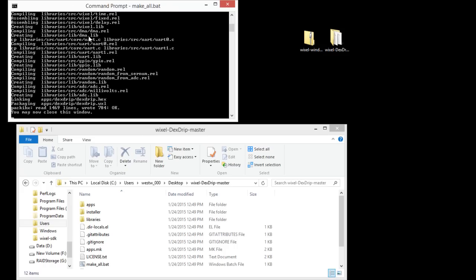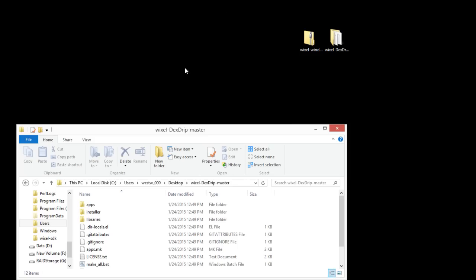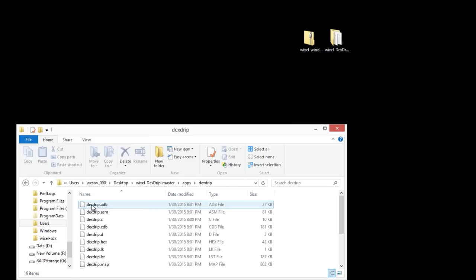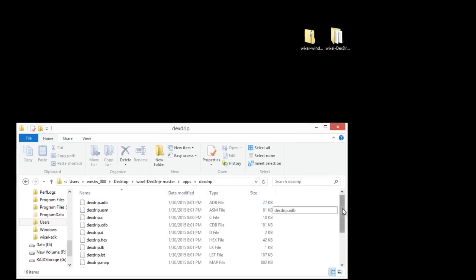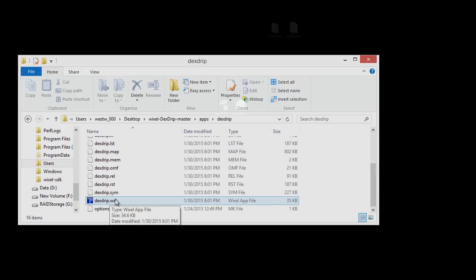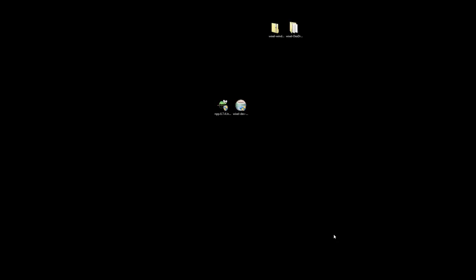And it's making our software for the Wixel. And we can exit out of that. And you'll see that when we go back into apps, in the Dextrip we have a whole lot of files now, and the Wixel app itself.